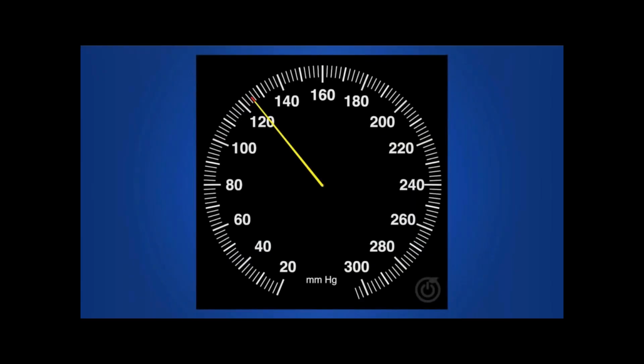When you arrive at the point of the procedure when you slowly deflate the cuff to hear the sounds, you will notice the needle move in a counterclockwise direction. It is at this point that you need to listen very closely for the thumping sounds. Upon hearing the first thump, note the needle's position on the dial and record the number. That's the systolic pressure. As the cuff deflates and the needle continues to move, you will continue to hear the thumping sounds. Listen closely for the last thump. Upon hearing the last thump, note the needle's position on the dial. That's the diastolic pressure.